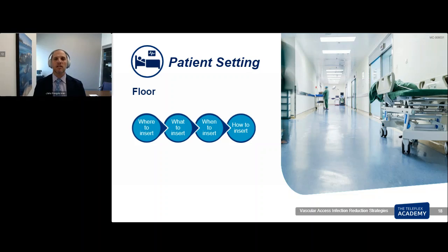And please, please, please don't reflex to a PICC line for everybody. PICC lines are central lines. They're just peripherally inserted. But they still have infection risk. They have thrombotic risk. And we need to do what we can to protect our patients.